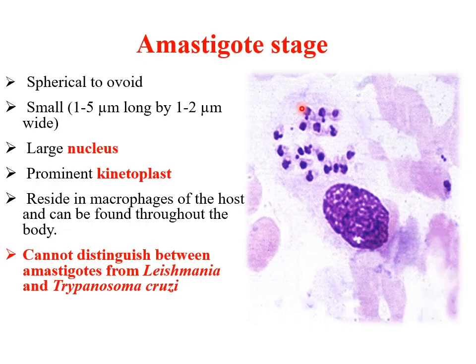So these amastigote stages are basically the clinical diagnostic specimen of the infection by different Leishmania species. It's worth noting that these stages are small. They lost their flagella, so they are not flagellated, and you can clearly see as well that they have a kinetoplast which occupies an anterior position compared to the nucleus.